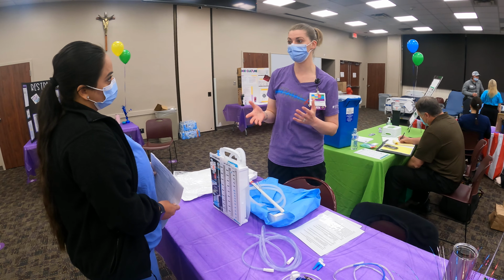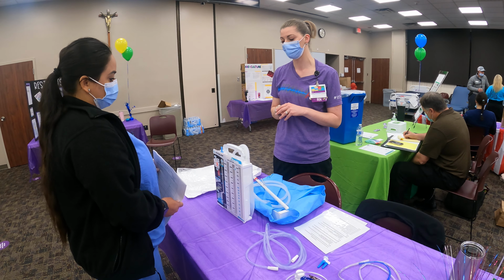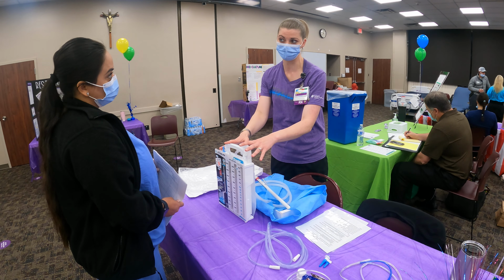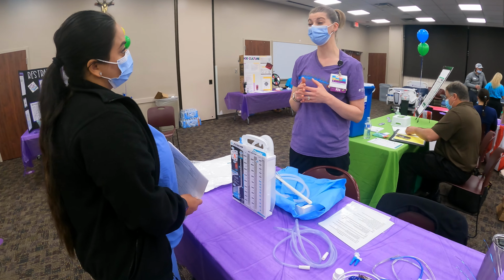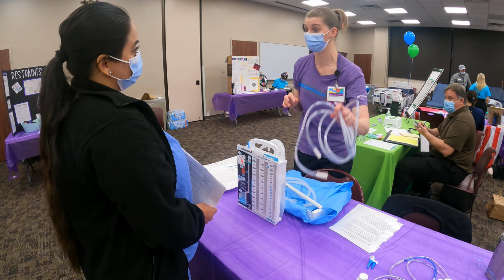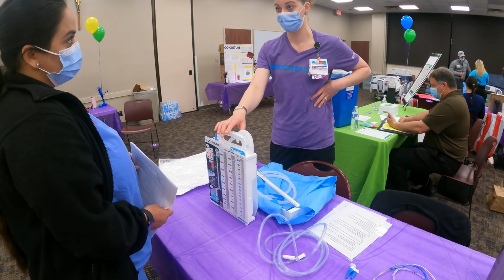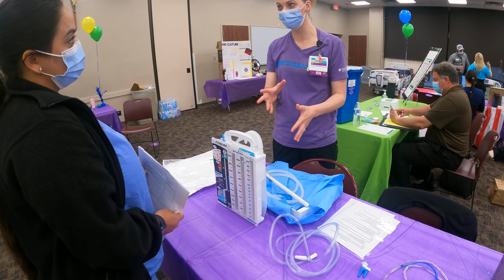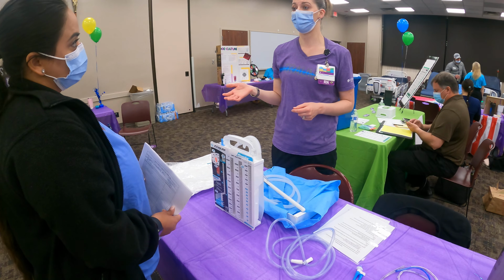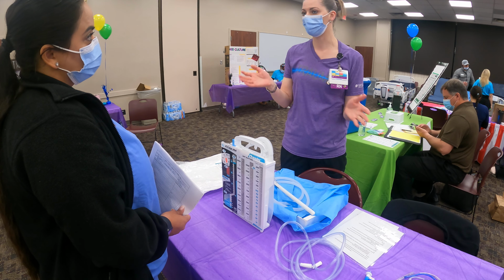It's okay to disconnect them if they're going down for a procedure, but we want to hook them back up as soon as they get back to the room. Okay? So if we're starting to wean somebody down, we want to see if they're going to do well without a chest tube in place. They're going to place an order for what's called water seal, and so that literally means that you're disconnecting this tubing. Okay? And so your patient is free with just the chest tube attached to them. Okay? We're going to trial them for about 4 hours, sometimes overnight, to see if they have a reaccumulation of a pneumo or a hemo. If they don't, then we take it out.